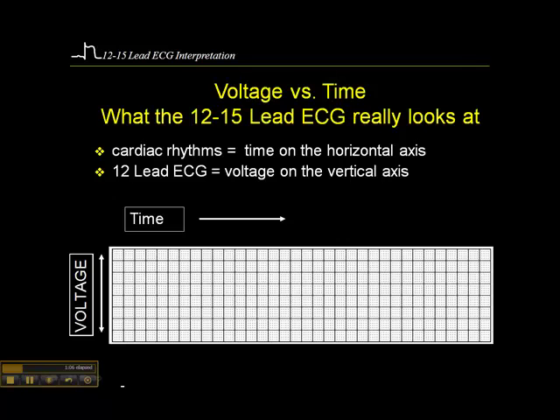And you might recall from my cardiac dysrhythmia interpretation workbook that QRS morphology and T-wave morphology, when it comes to rhythm interpretation, is completely and utterly irrelevant to our interpretation of the rhythm. But in a 12-lead, it becomes critically important because QRS morphology, for example, may help determine whether we're dealing with someone who has a right bundle branch block or a left bundle branch block. Atrial morphology might determine whether we're dealing with someone who has atrial hypertrophy, right or left atrial hypertrophy. Not that that's particularly critical information, but it's interesting to note.